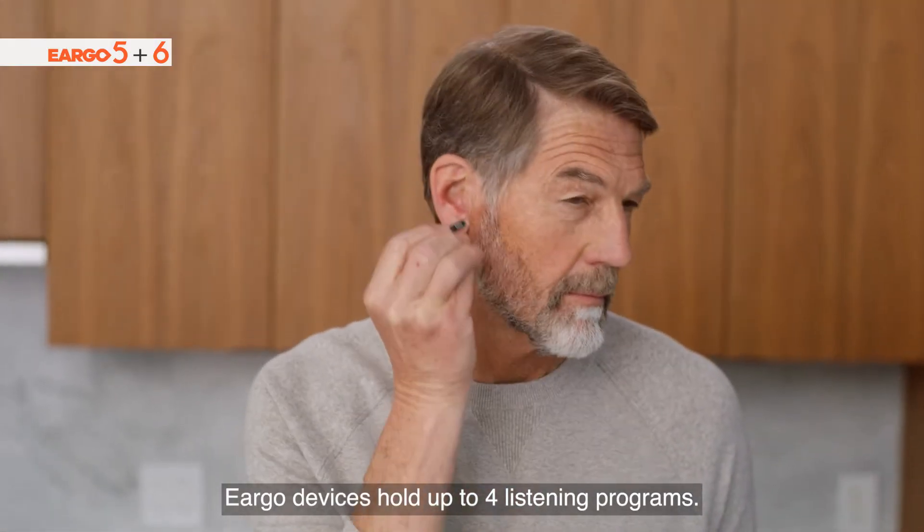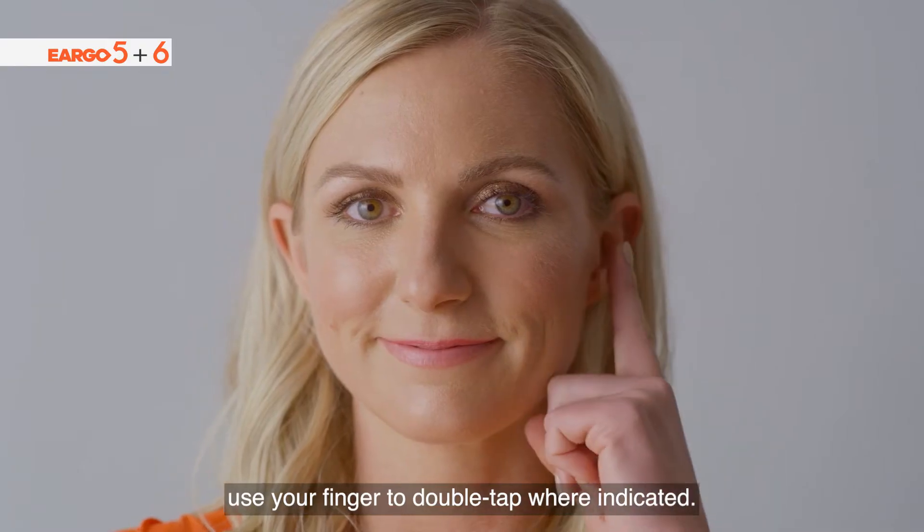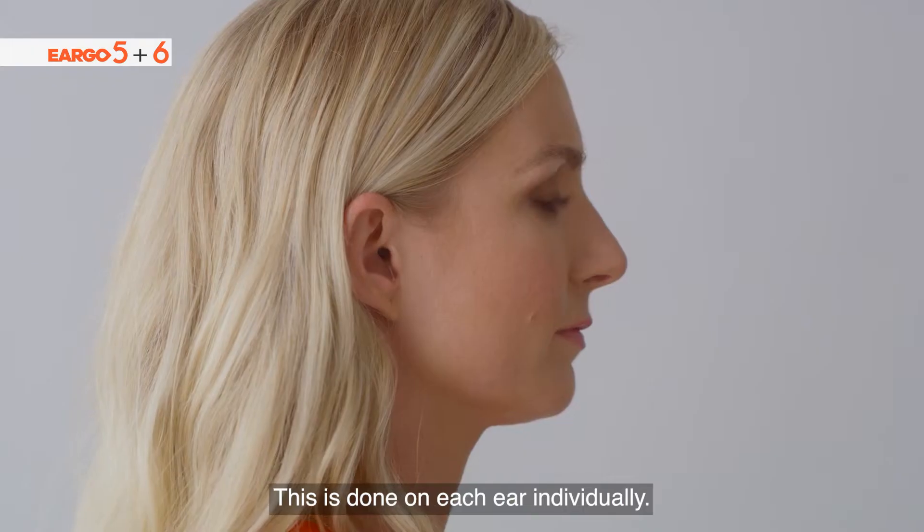Eargo devices hold up to four listening programs. To move from one program to the next, use your finger to double tap where indicated. This is done on each ear individually.